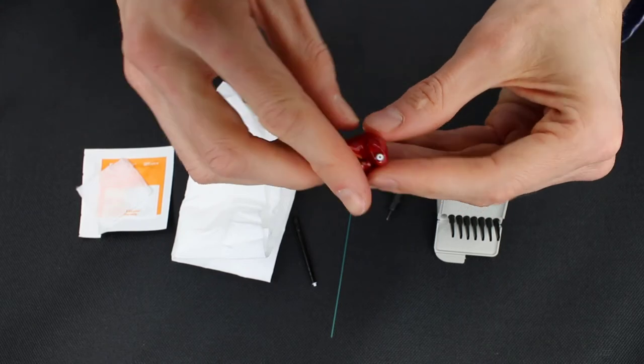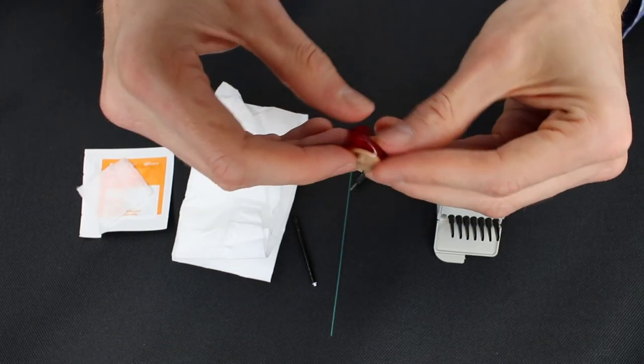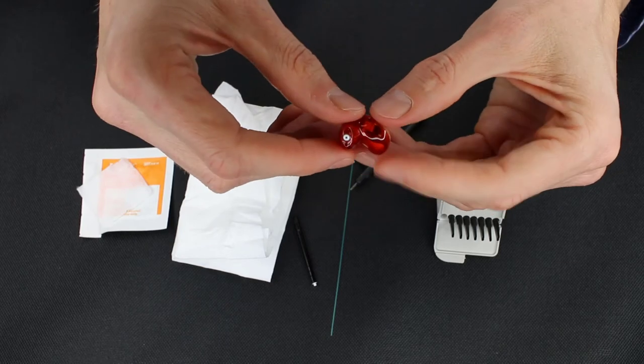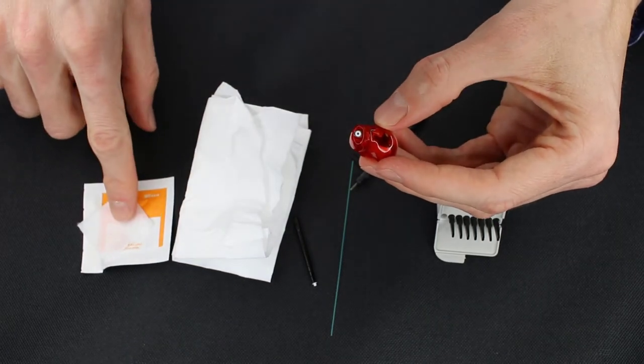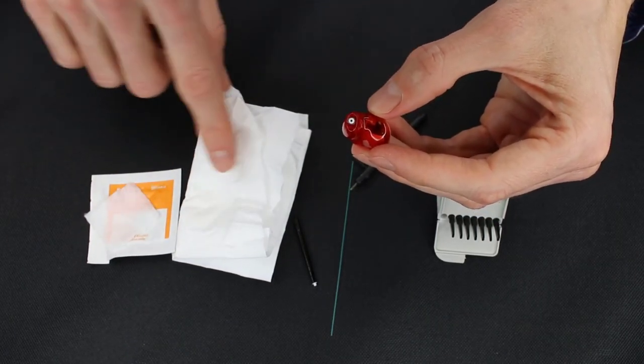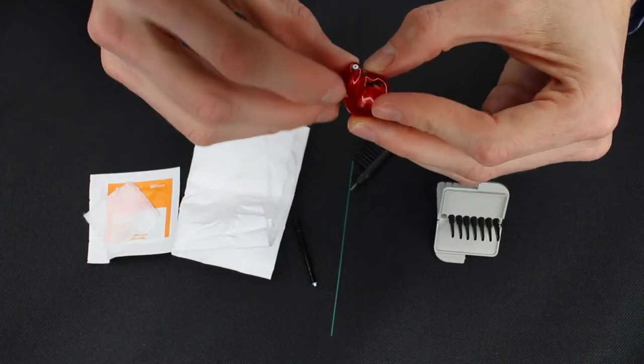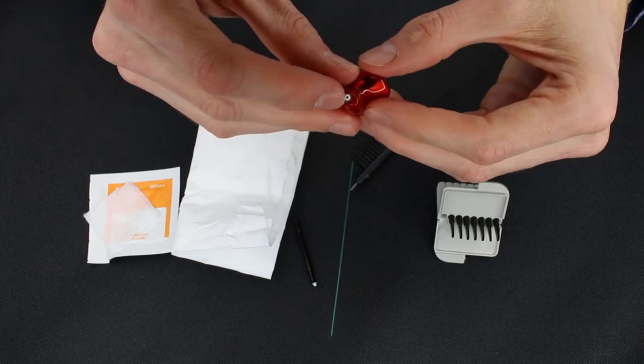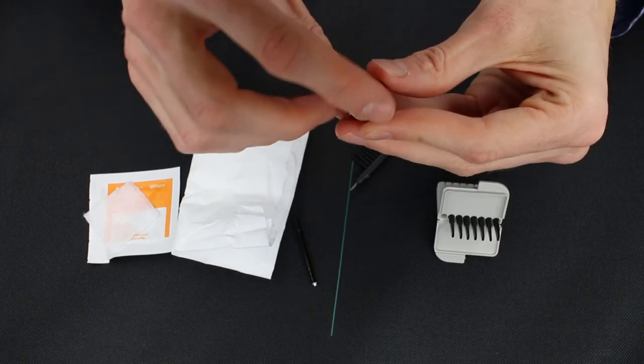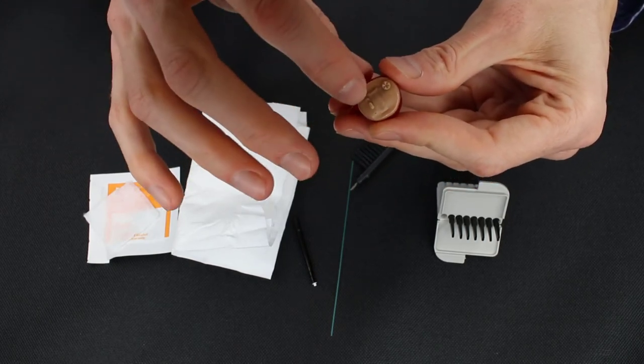When you're done with that, the hearing aid is pretty much clean at this point. We wiped it down, either with an alcohol pad or with a Kleenex. We punched the vent hole with our bore punch. We changed out the wax trap, and we brushed off the entire faceplate, including the microphone covers.